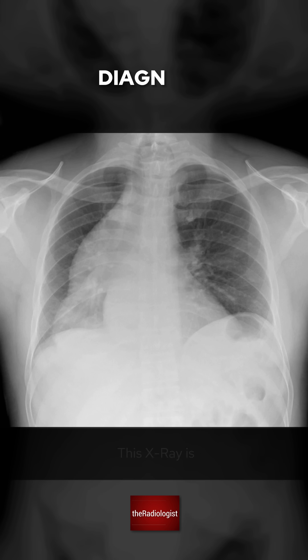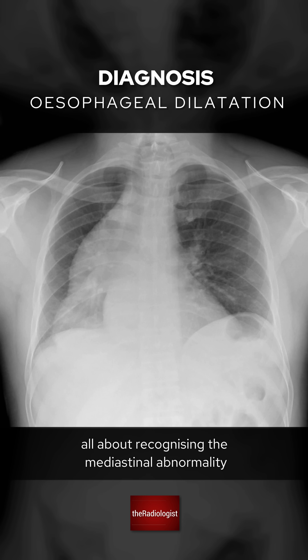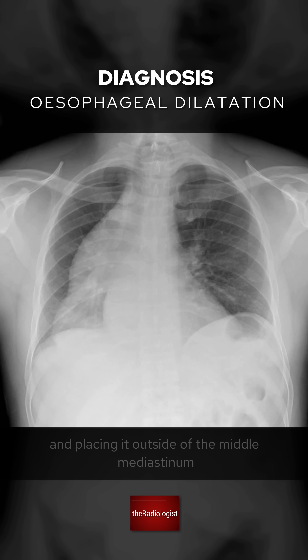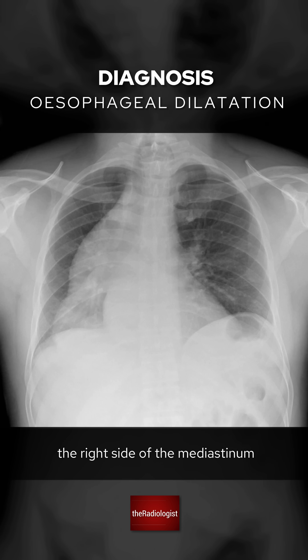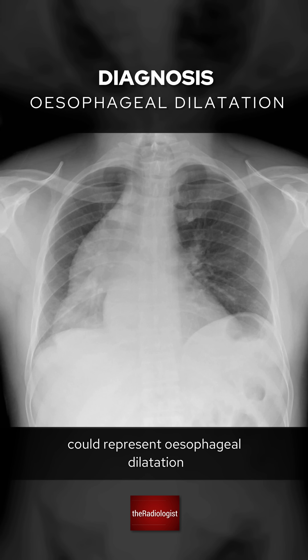This x-ray is all about recognizing the mediastinal abnormality and placing it outside of the middle mediastinum, and realizing a tubular structure occupying the whole of the right side of the mediastinum could represent esophageal dilatation.